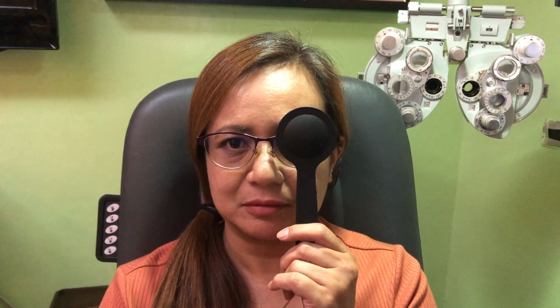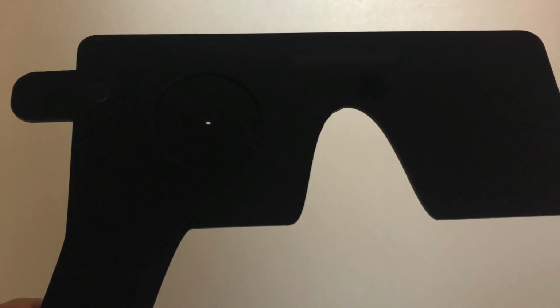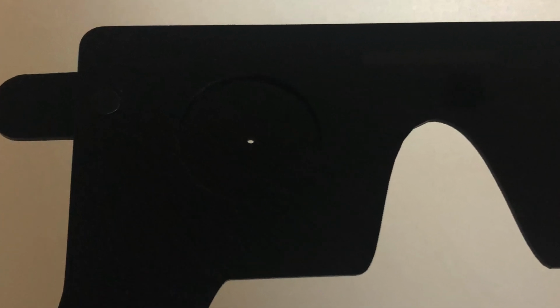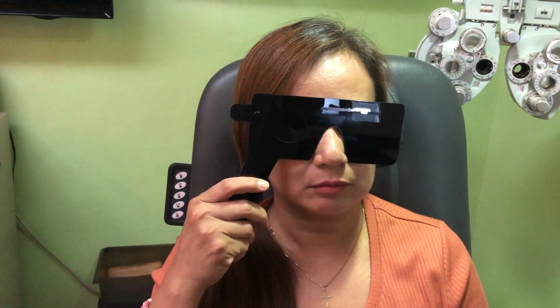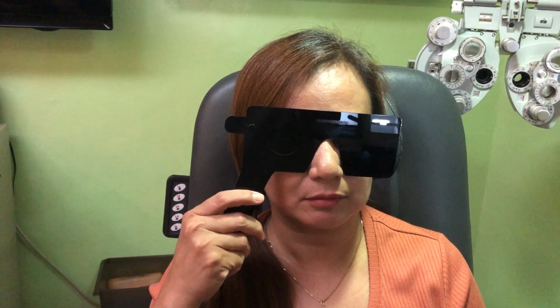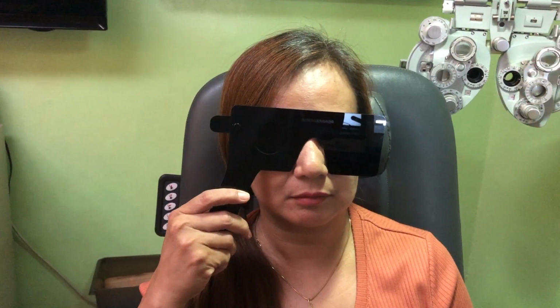Now, for the second part, let's test by asking the patient to wear glasses if they already have those. Otherwise, skip to the next part. For the third part, if the visual acuity is less than 20/30, then you should do a pinhole test. Pinholes act as universal glasses, and an improvement in vision when using them indicates a likely refractive error. Spectacles or eyeglasses should improve your patient's vision.